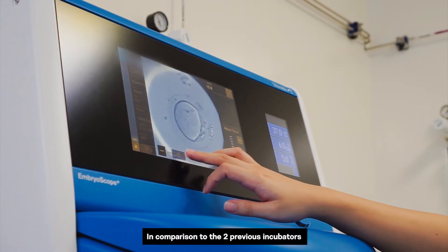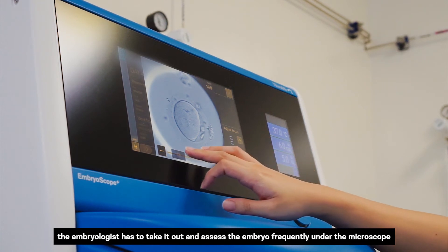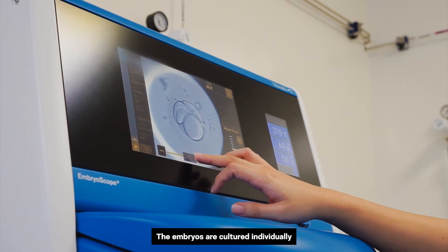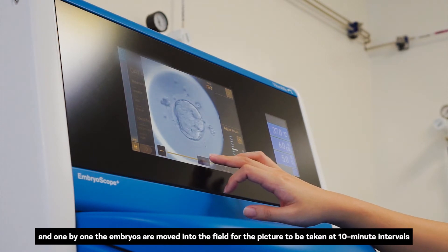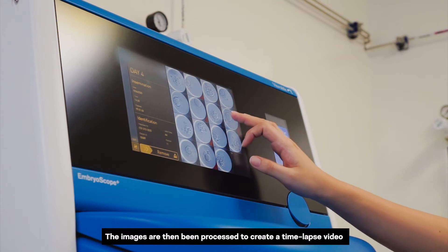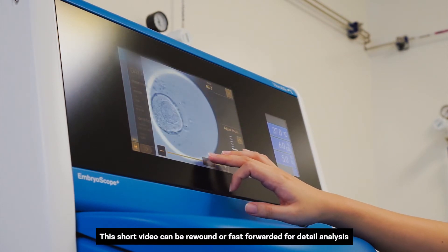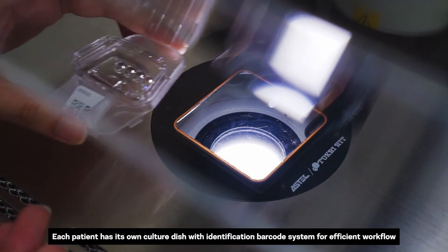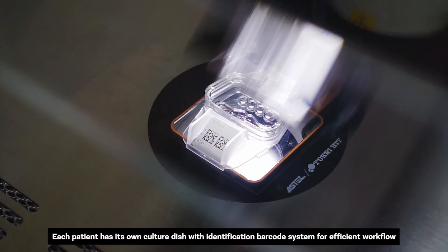In comparison to the two previous incubators, the embryologist had to take embryos out and assess them frequently under the microscope. With the Embroscope Plus, the embryos are cultured individually and pictures are taken at 10-minute intervals. The images are then processed to create a time-lapse video, which can be rewound or fast-forwarded for detailed analysis.